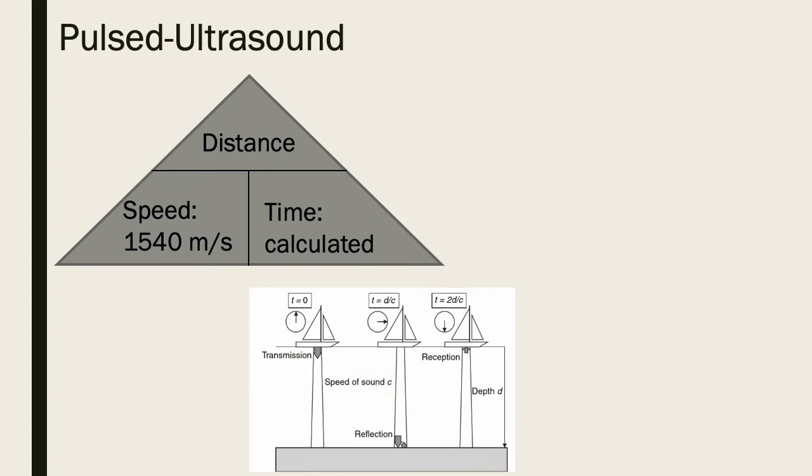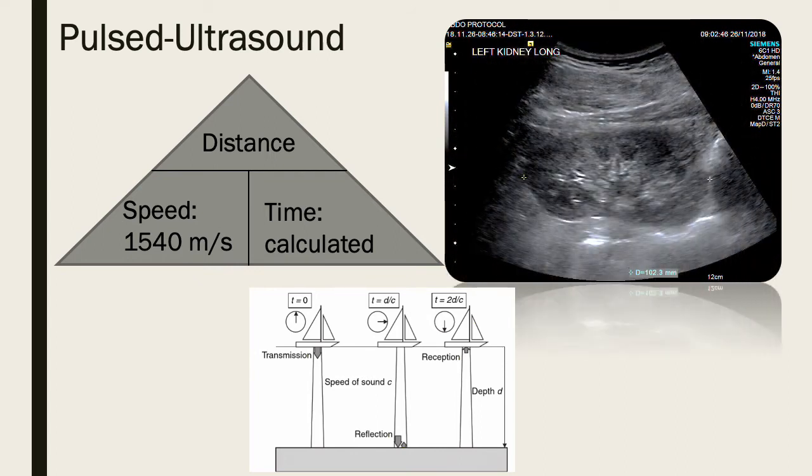So I've even got a pretty little drawing here for you guys so that you can kind of see that. And you can see in this image of this really lovely left kidney, if we're going to assume that this entire image is made up of, let's say, 200 scan lines, it means that one scan line was sent through here, and when the information got back, then another crystal, or another bunch of crystals, would have sent out another scan line to build this one as it slowly goes through this entire image to put together all of the information.